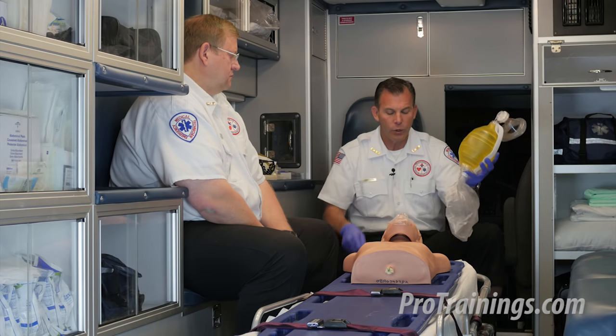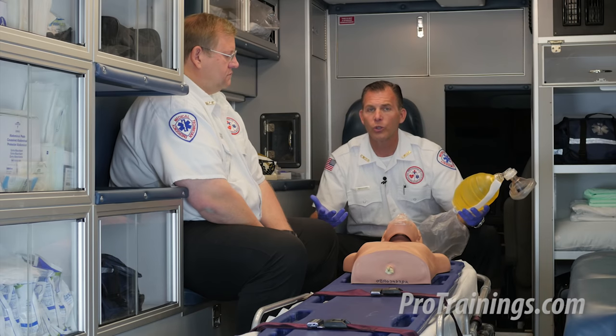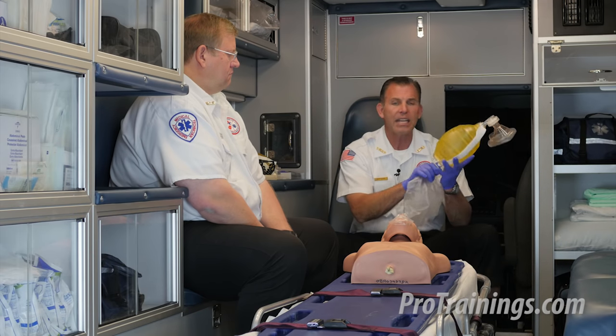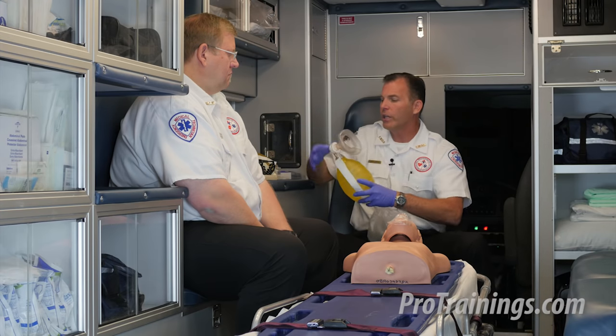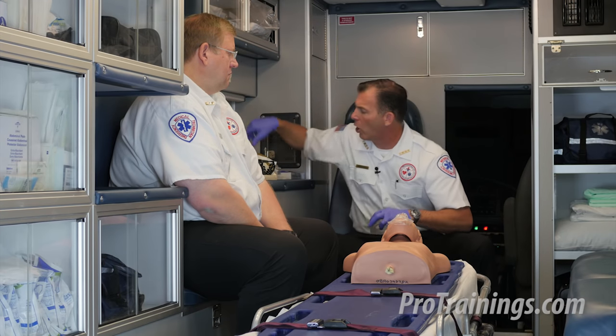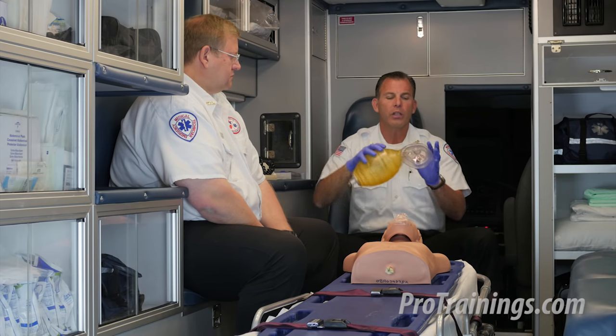However, you may be in a system or environment that does not have high-flow O2 regulators. In that case, I would suggest pulling off the reservoir and using it as a room-air-only bag valve device — and that's what it would look like here.